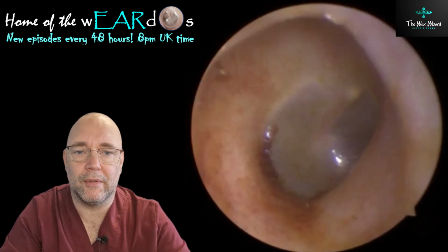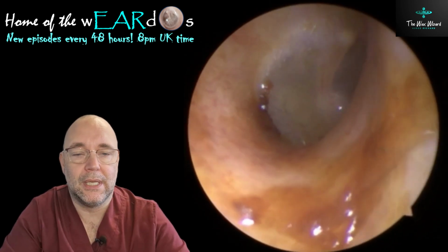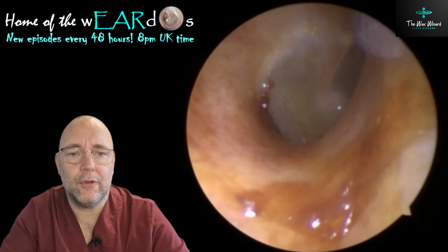Not too concerned about that other stuff around the bottom. Really not worth the risk of going in for that. Worth getting that little bit off the drum, but not little bits around the edges. So let's just have a little tidy up there.